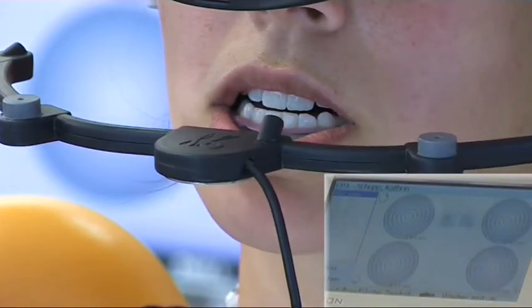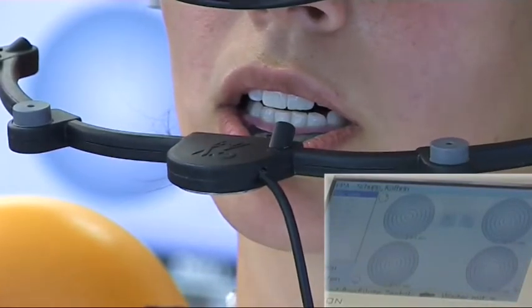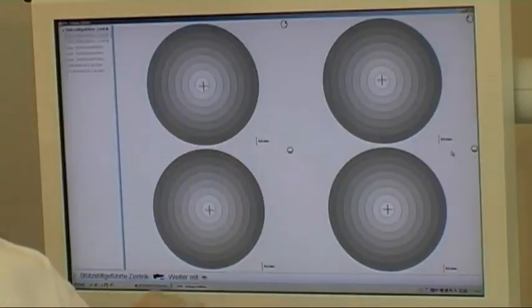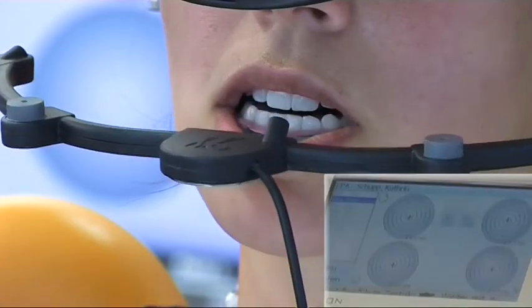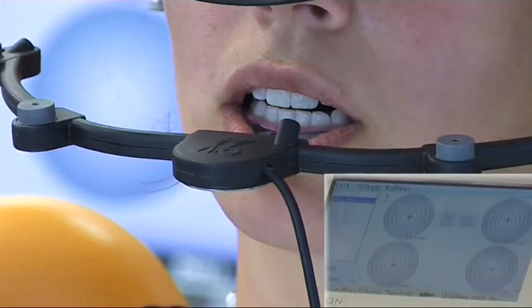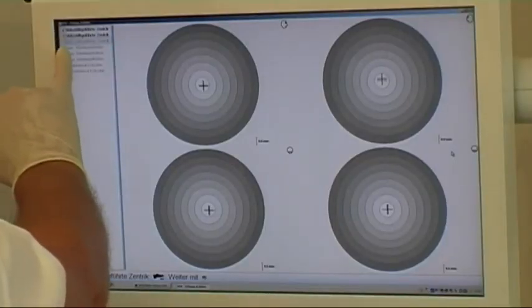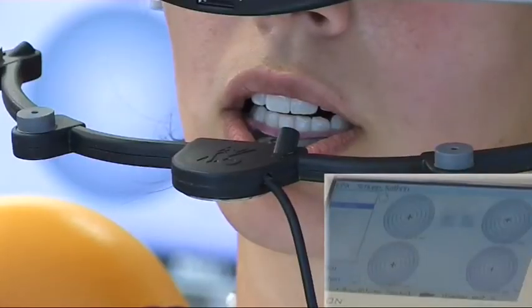The patient is asked to move the lower jaw back and forth. The position is measured and we can now see this position in relation to our reference point. We carry out this measurement three times to check repeatability. With this patient we see a very good reproducible eccentric position.